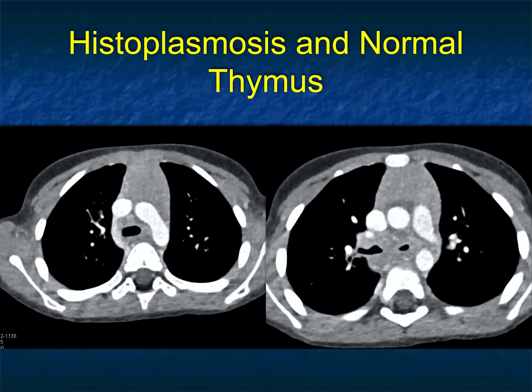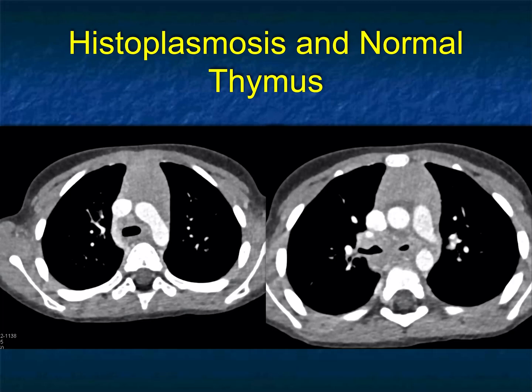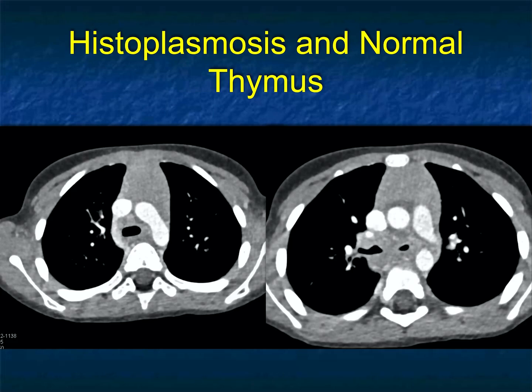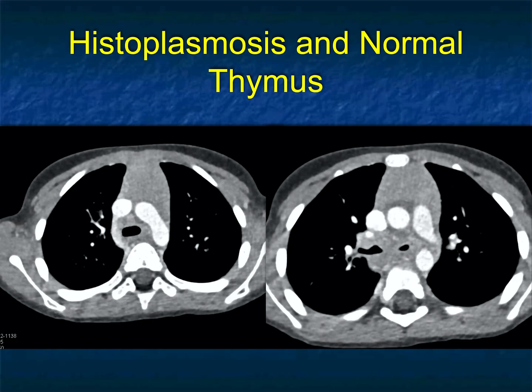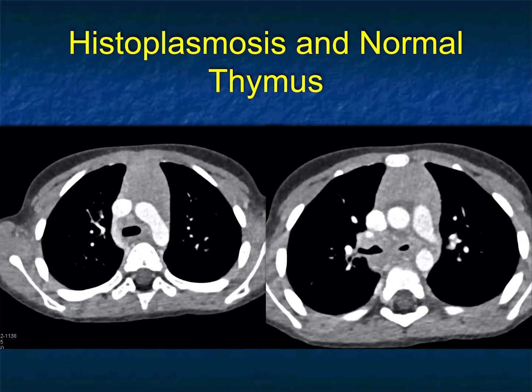If you said histoplasmosis with a normal thymus, you were correct. There are some beautiful 3D images in this case of narrowing of the airways, but the nodes with calcification and infiltration put you toward an inflammatory rather than a neoplastic process. But again, biopsy was critical.